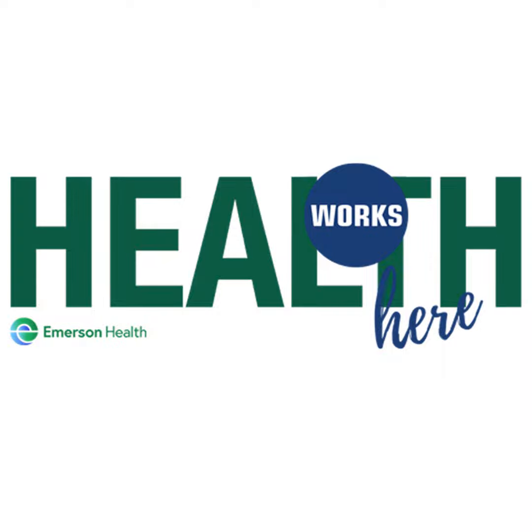robotics. And part of it is there's something on the robotics called haptics, which prevents us as surgeons from going even a half millimeter further beyond the bone into soft tissue where you could cause some sort of trauma that might take a little bit longer to recover from, something that's beyond what we can do just holding the tools by hand. And those sorts of haptics, I really think are the difference between doing these things by hand and doing them with robotic assistance.